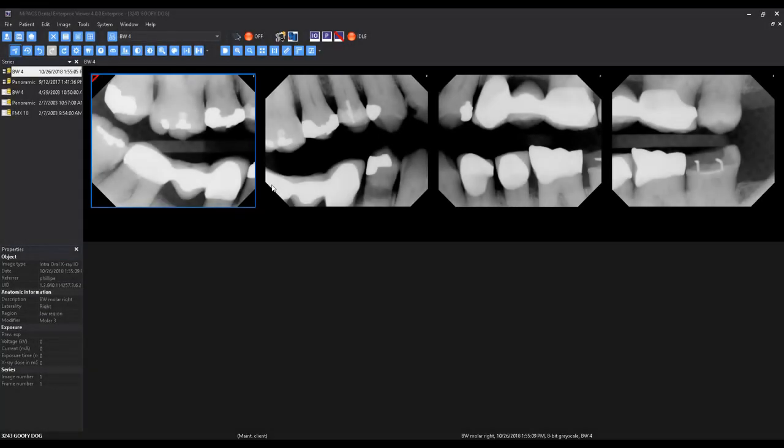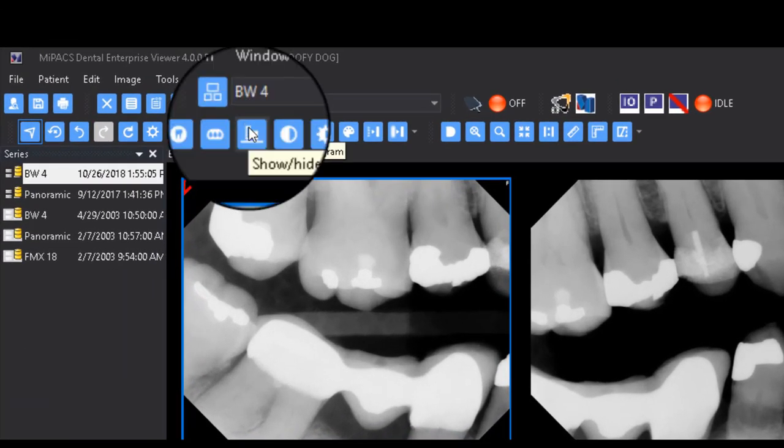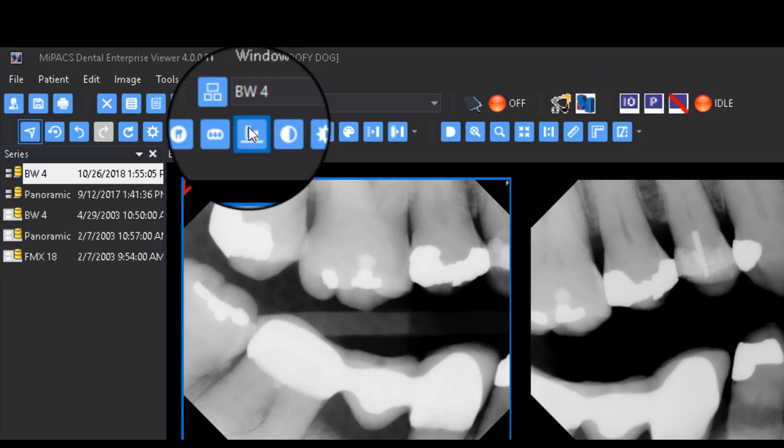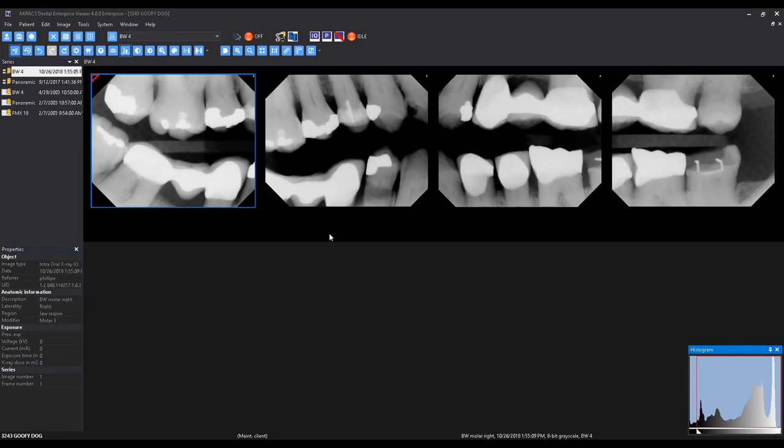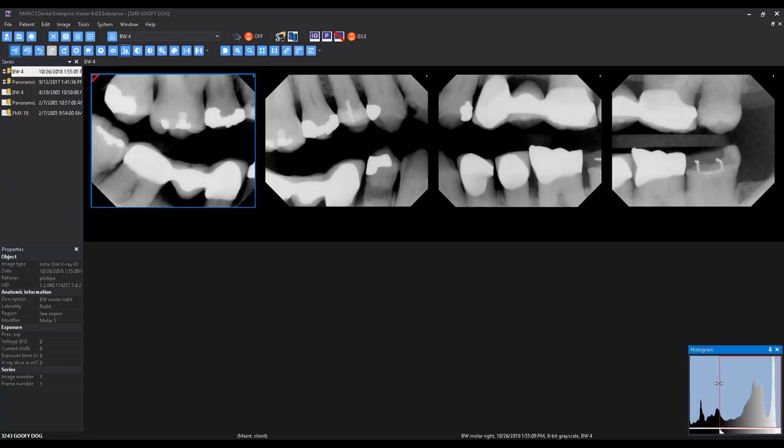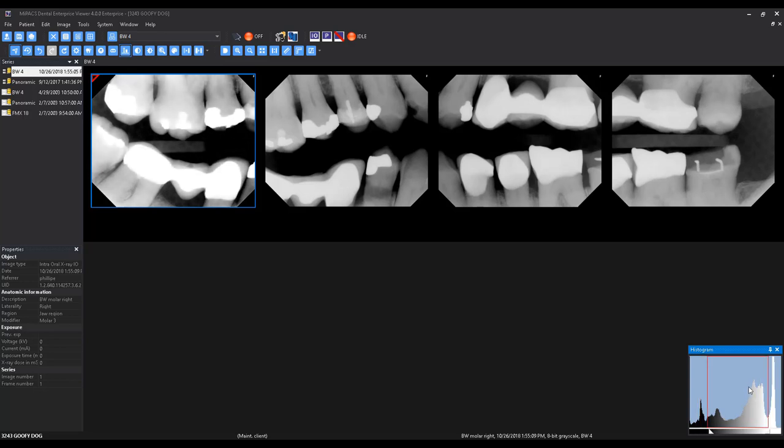The stretch histogram feature can also be used to adjust brightness and contrast with a bit more control of the image data. Select the Stretch Histogram button and manipulate the edges of the red box in the histogram dialog to alter the range of blacks and whites in the image.